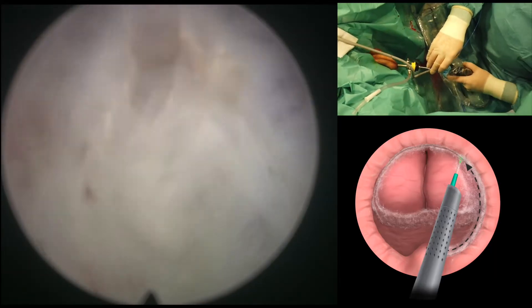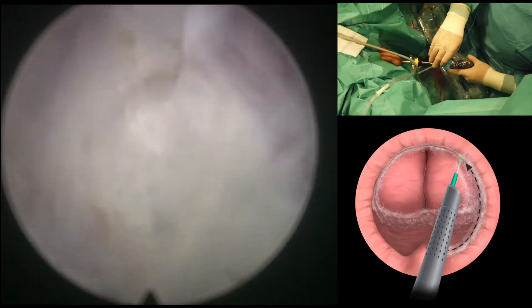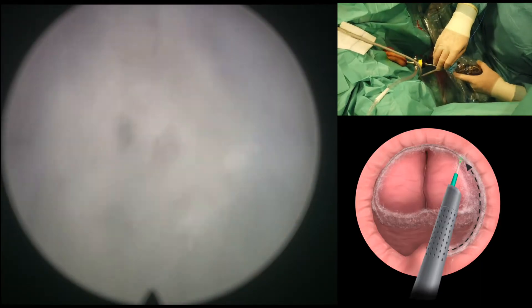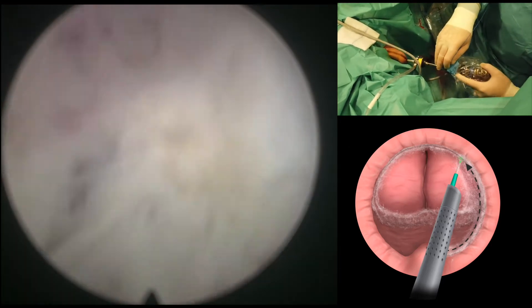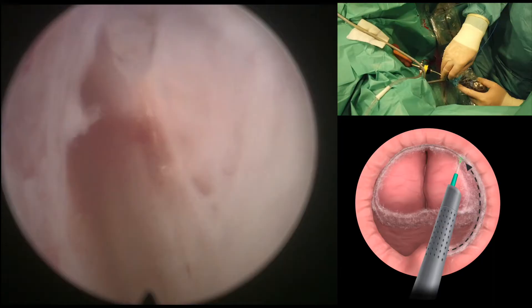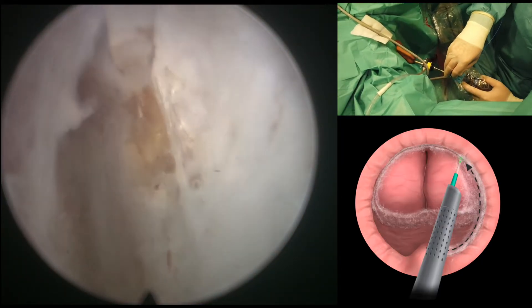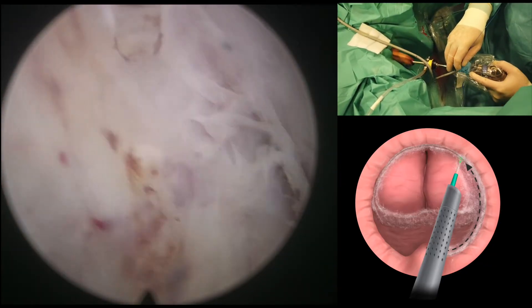I like to do an initial posterior apical dissection and deepen it towards the bladder neck until I can connect with the posterior line of attack, because it's important to be able to go around the adenoma and to have a continuous line that connects the lateral plane with the posterior plane with the anterior plane. It's very important to connect the lines that we are developing.